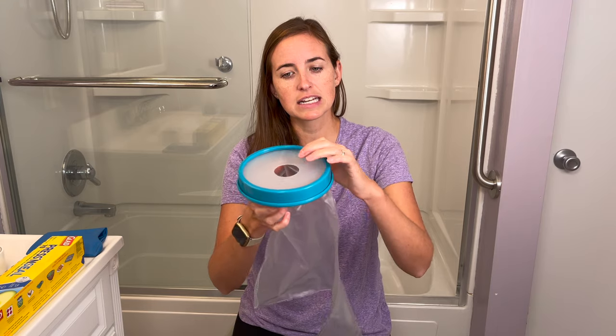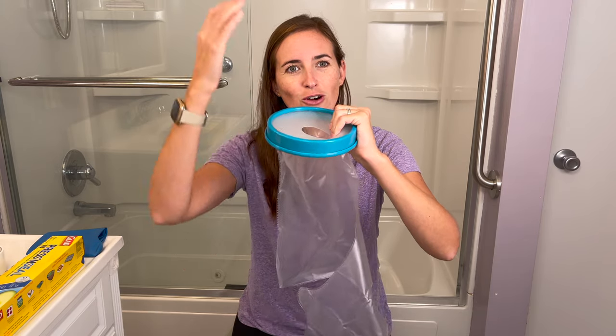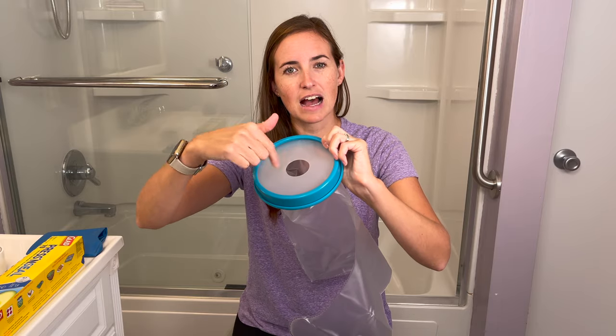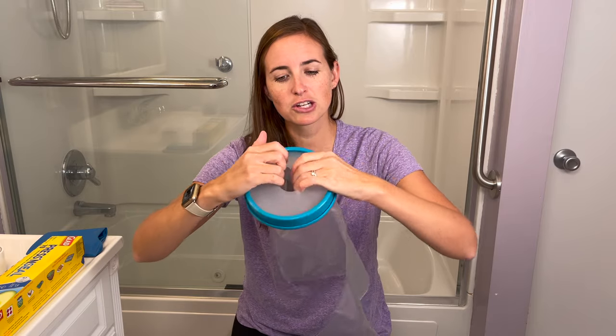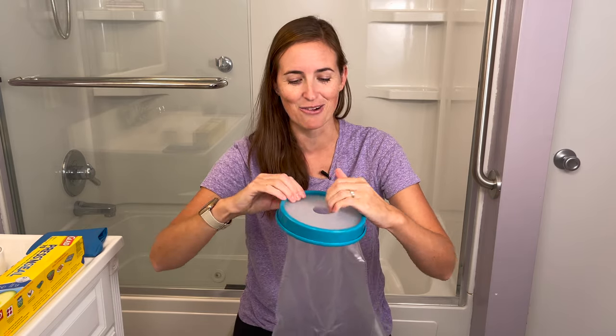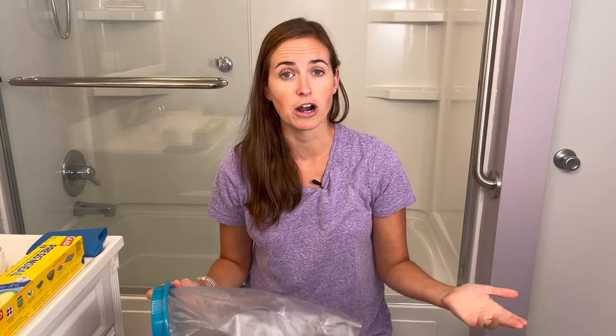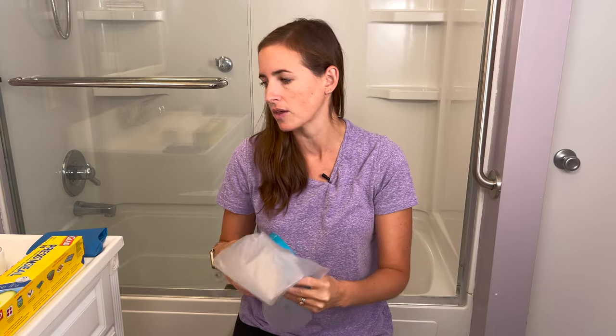When you remove it, if you press down you're going to dump whatever remnant water is on top into the cast. Make sure you lift up when you go to remove it — that will keep the water up and out of the cast versus dumping it in. We've learned this from experience. And always have your trusty blow dryer on standby in case the cast gets a little damp so you can dry it quickly.